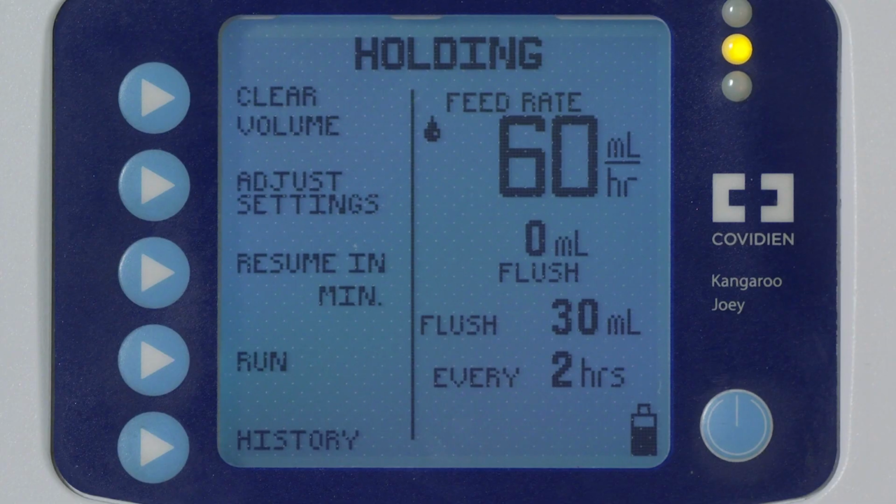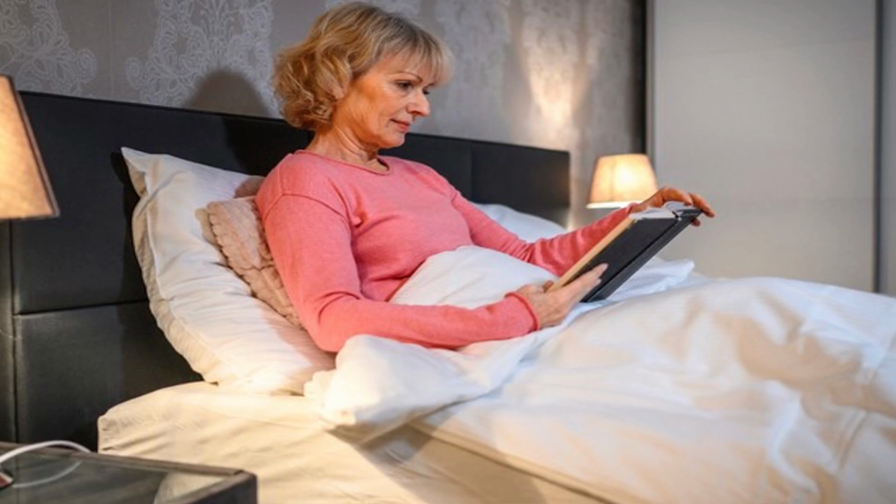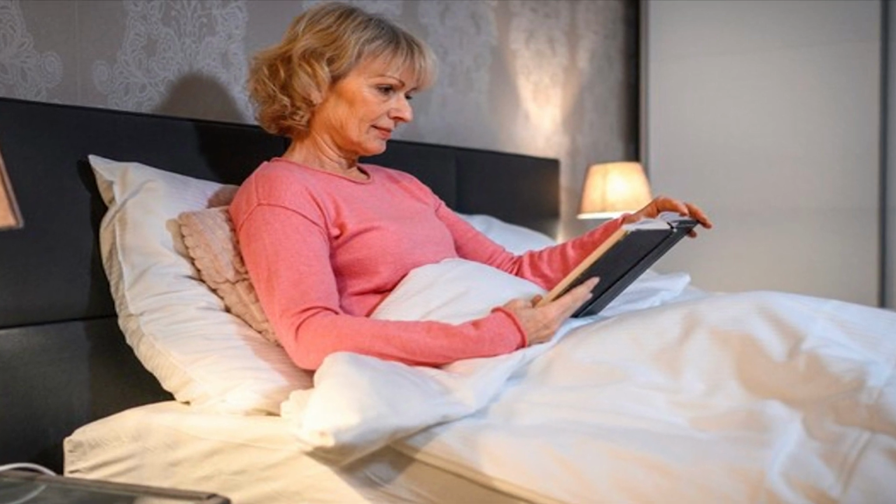Keep these things in mind. A fully charged battery can run up to 12 hours. At night, double-check that the pump is plugged in to charge. While you are on tube feeding, make sure your head is always elevated at least 30 degrees.